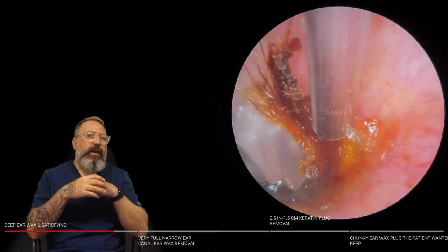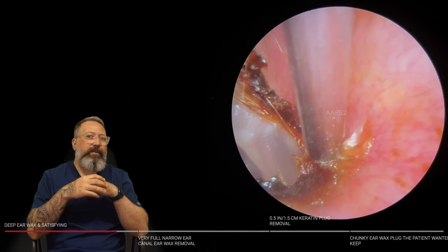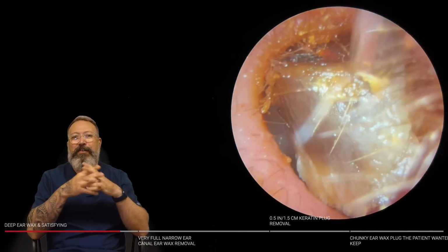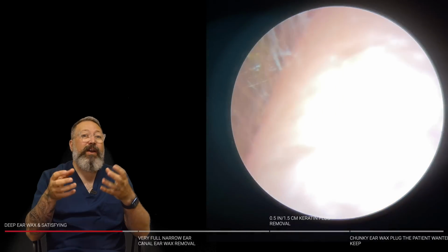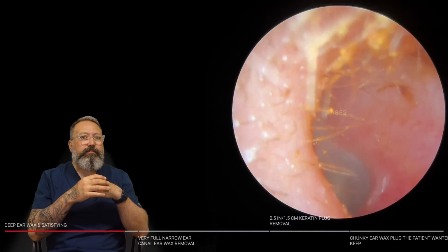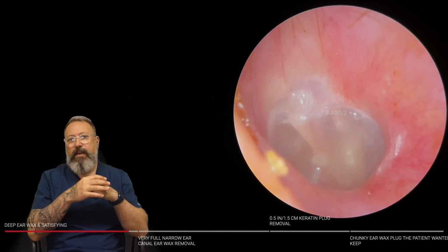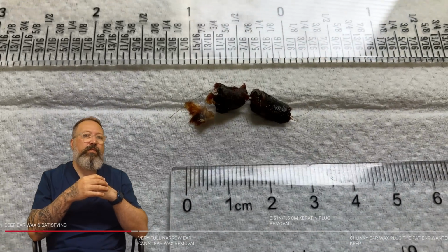There you go. So watch this as it peels away now. There we go. And a bit more of a lift. Look at that coming away, all scooped out from the anterior recess as well. That's a very thick kind of keratin layer underneath there, which is why it held together really, really well when we peeled it. There's the eardrum looking nice and healthy. So this is what it looked like beforehand. And this is what it looks like afterwards. And that's what we removed. So 2.5 centimeters, 1 inch worth of earwax there, guys.